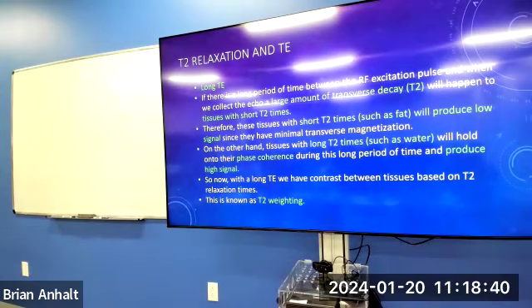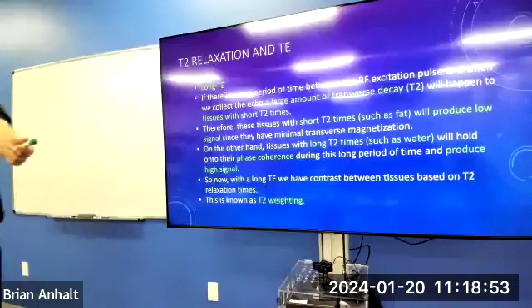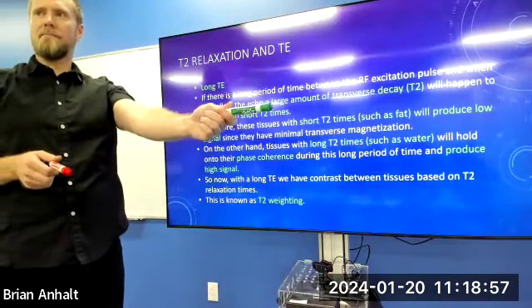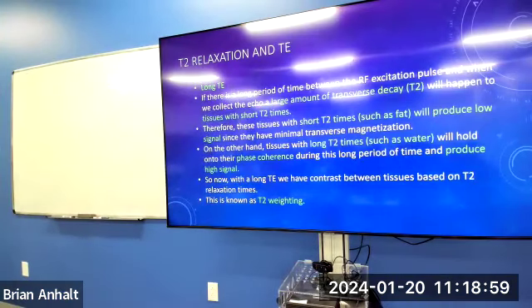So once we flip, immediately we start having the protons go out of phase. Ignoring the 180-degree refocusing pulse, let's just pretend that's not happening. Protons are decaying. Some of them decay at a faster rate than others, right? So I know it's going to confuse it because the 180-degree didn't happen. In reality, it goes like this.